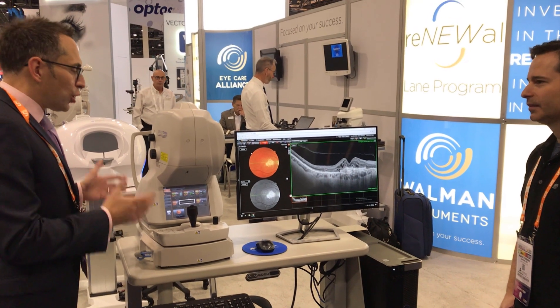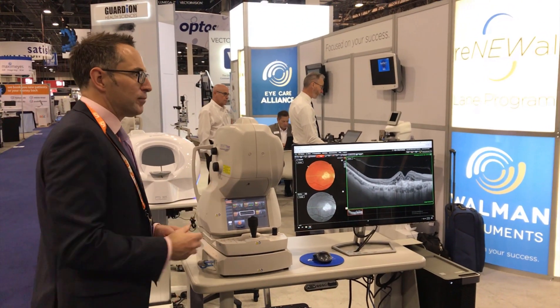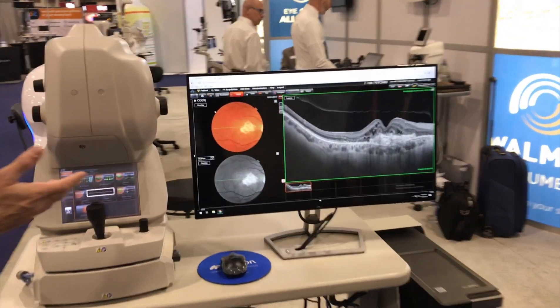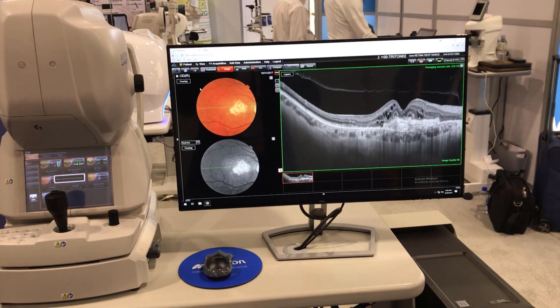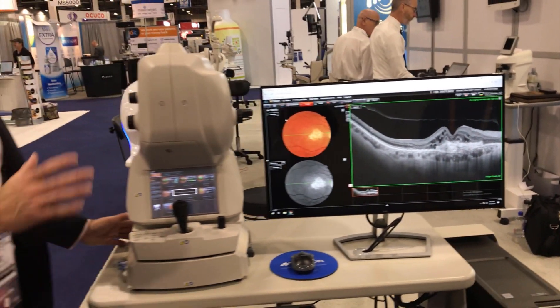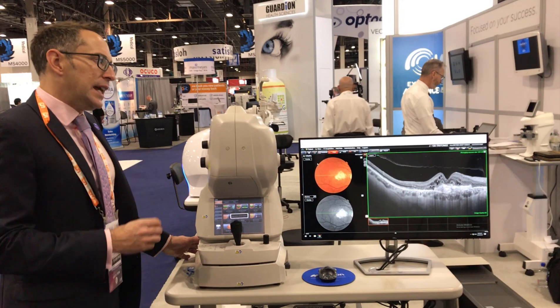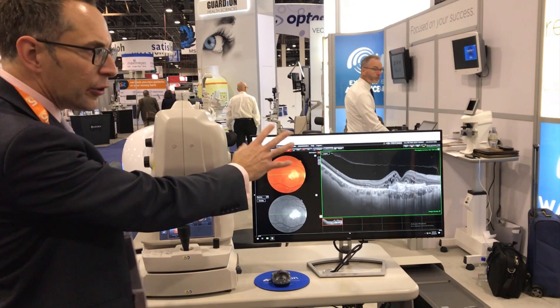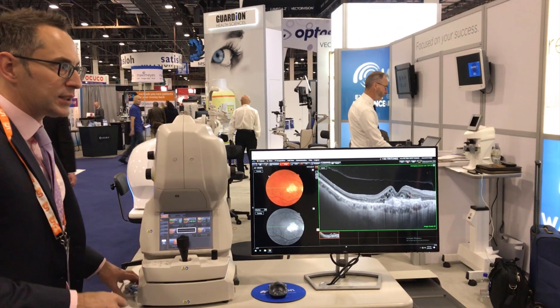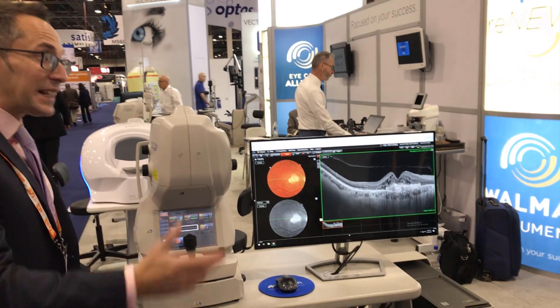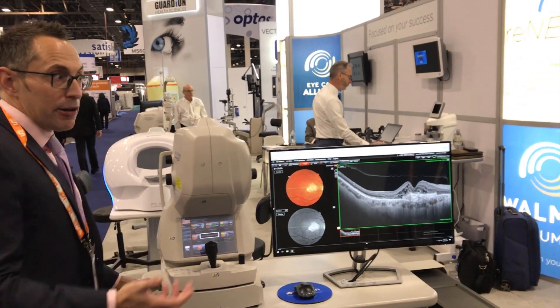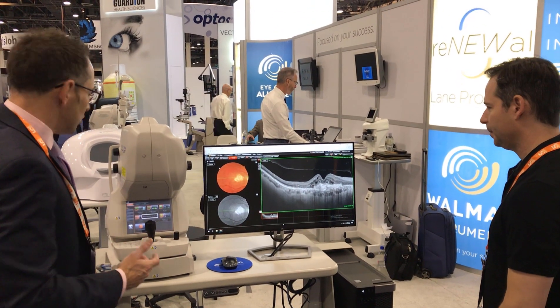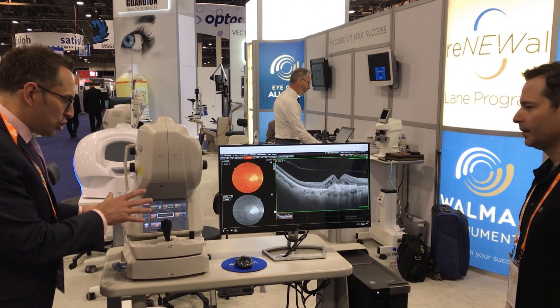The swept source device comes into its own when you've got a sick eye, an unhealthy patient. The example on the screen you can see very clearly is different from the image we were looking at earlier with the Maestro. What 1050 nanometers of wavelength gives us is penetration — a depth of image unparalleled compared to our spectral domain machines. It allows us to penetrate opacities — cataracts, hemorrhage — and it also captures twice as fast.